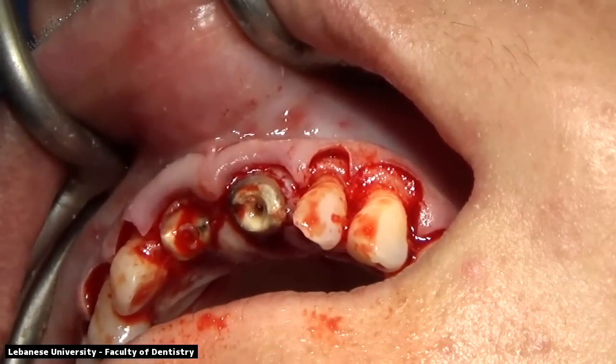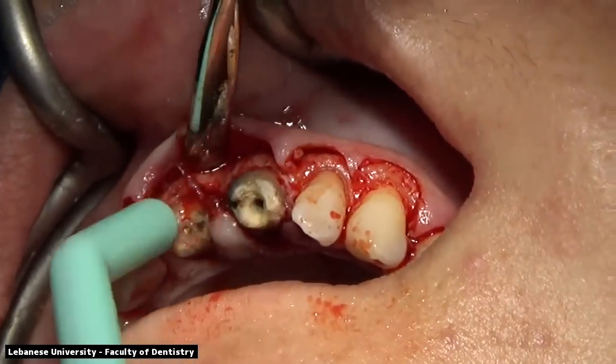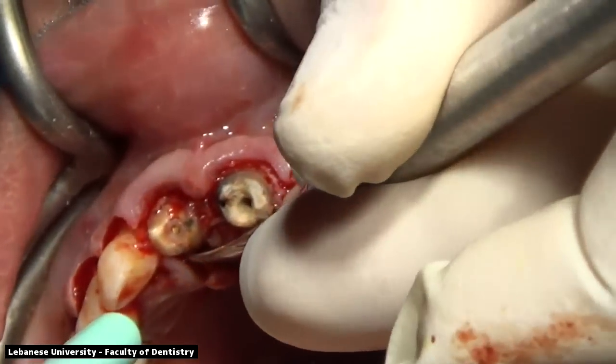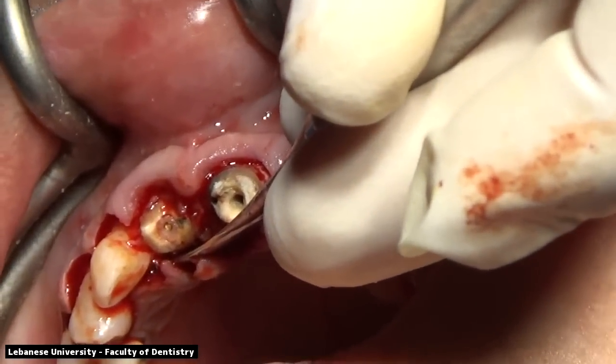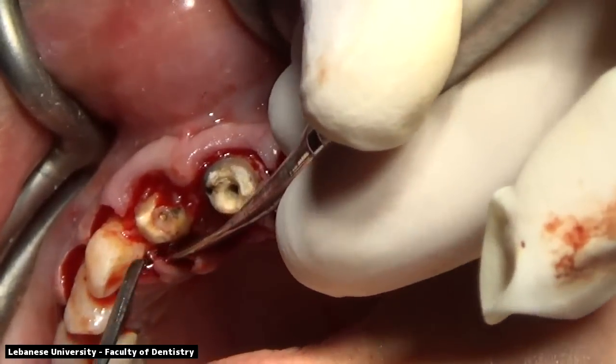Now we're going to be using the periotome to remove any periodontal ligament attachments and any adhesions to the remaining roots at the site. The periotome is very essential so that we do not widen the bone and we do not create any trauma on the buccal plate of bone, which will be crucial for the success of the implants in the aesthetic area, to prevent any recession of the soft tissue at a later point.